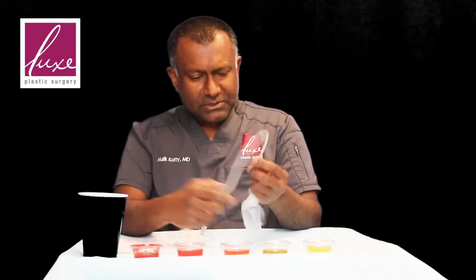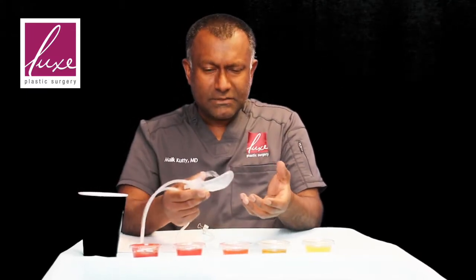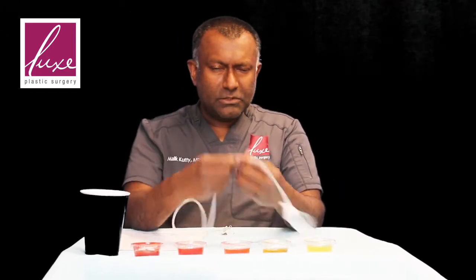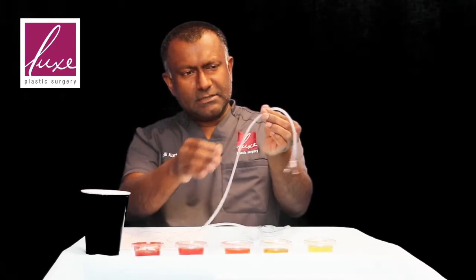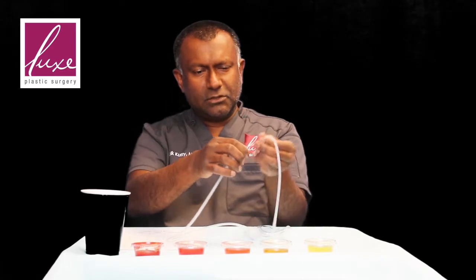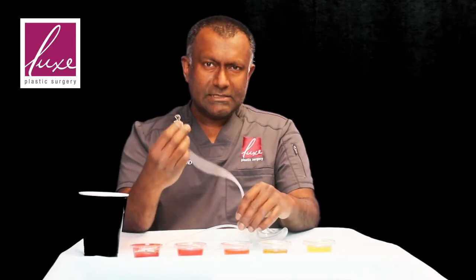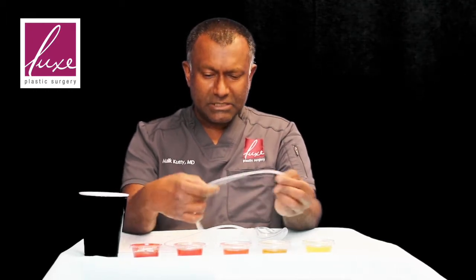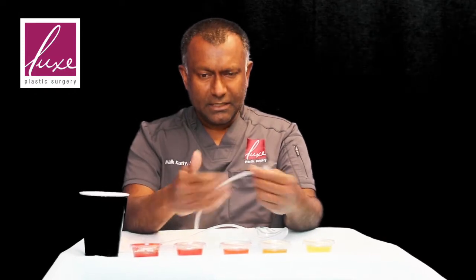One of the things that happens with these drains is that all of a sudden the patients will feel like nothing's coming out of it, maybe it's ready to come out. It's very important when these drains are in that you kind of milk it, which means holding it somewhere near the skin and just kind of gently pulling along the tubing, because sometimes something gets stuck in the tube and it prevents anything from coming out. And if you see drainage coming out from around where the drain is exiting the skin, that means the tube is blocked. So you have to make sure you clear that tube so it's actually working and getting everything out of there.